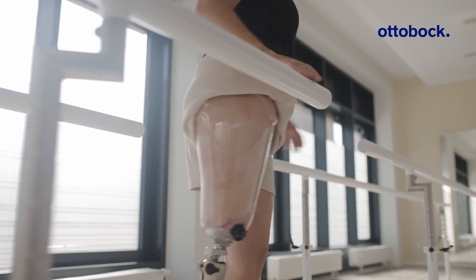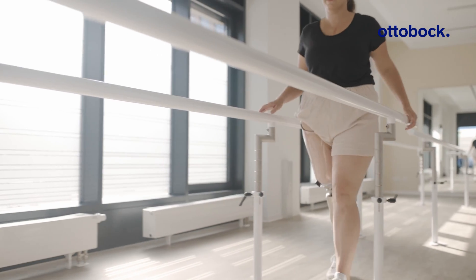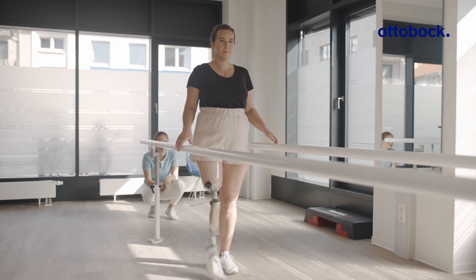The first steps with the test socket were really good. There were still a couple of areas that caused some discomfort where it wasn't 100% flawless, but it already felt like a really good fit.